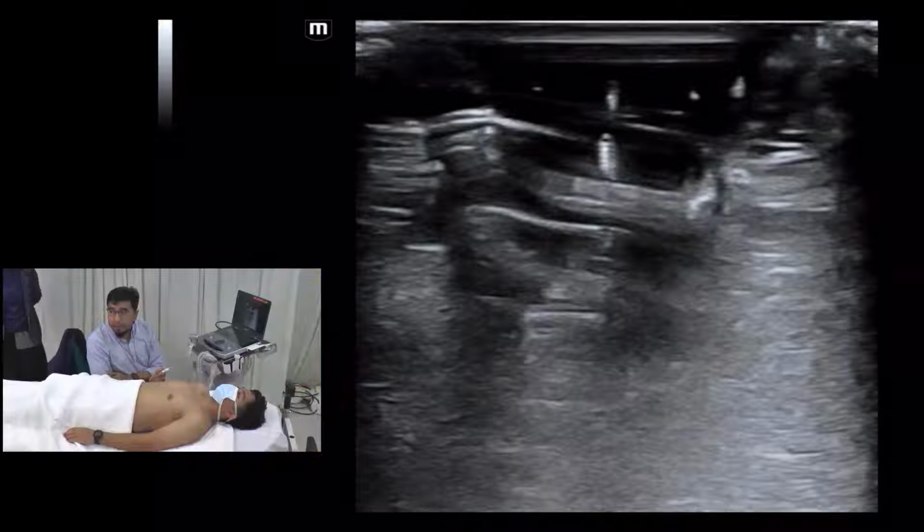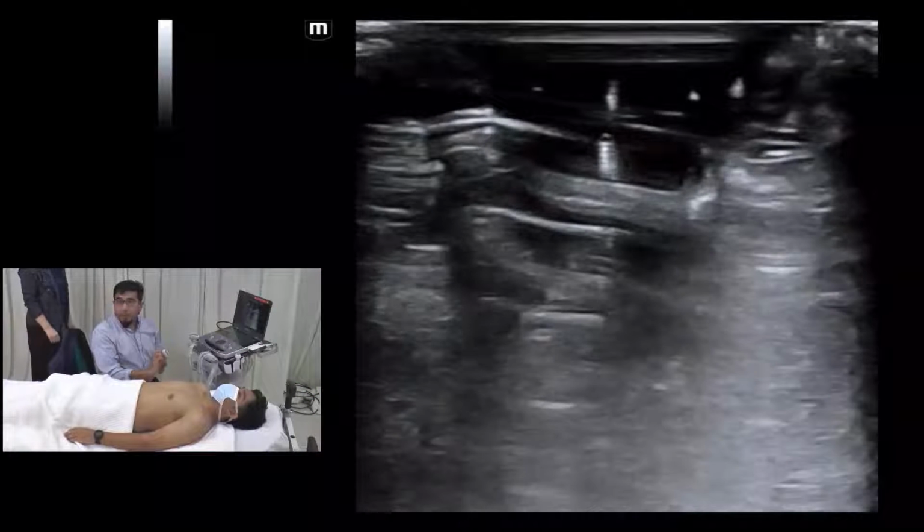Okay, so linear probe, the marker will be, so this one. Again by convention, Sean, can we get your technician to put the picture in picture? Okay, picture in picture, guys. Because we can only see the ultrasound image, but not your and the transducer view. Yes, I think they've got a problem with the camera. We are sorting it out. Okay, that's fine. Just hang on for a minute. Okay. Yes, you're live, back live now.